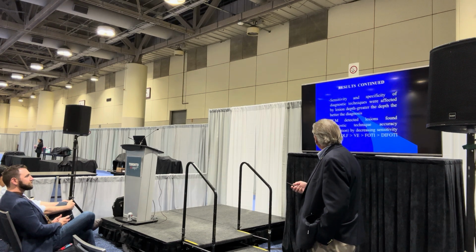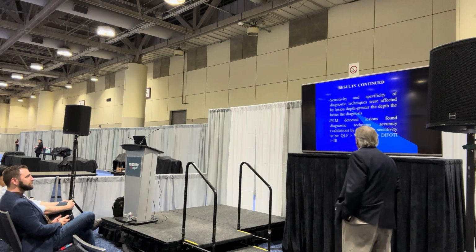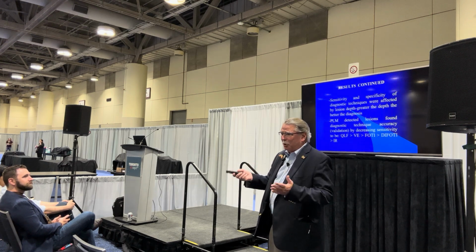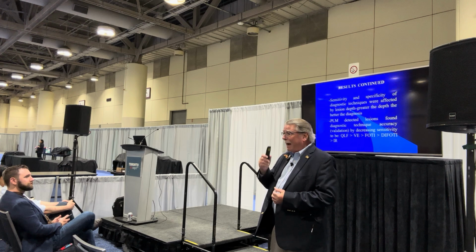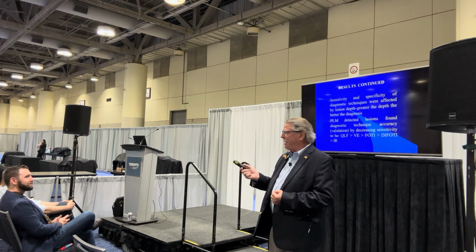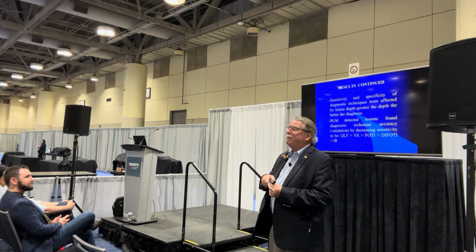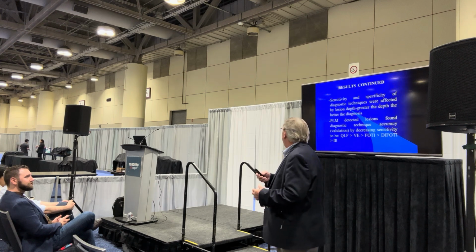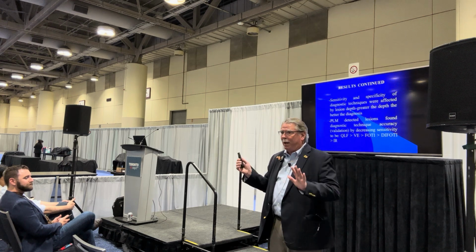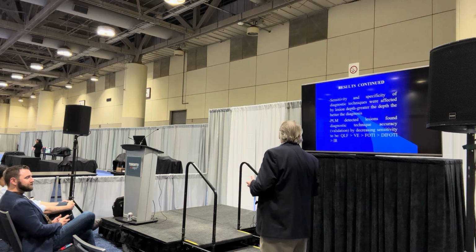So the sensitivity and specificity of the techniques were affected by lesion depth. Obviously, with your eyes, the deeper it is, the more you're convinced it's there. And you guys are way better diagnosticians than you think you are. You flip that mirror around and you see white spots, and you see them quick, way faster than parents see it. So anyway, people were saying, "Kevin, you're really hammering on Diagnodent." I said, "No, I'm not. It can be helpful, but you will find that it's not the answer."